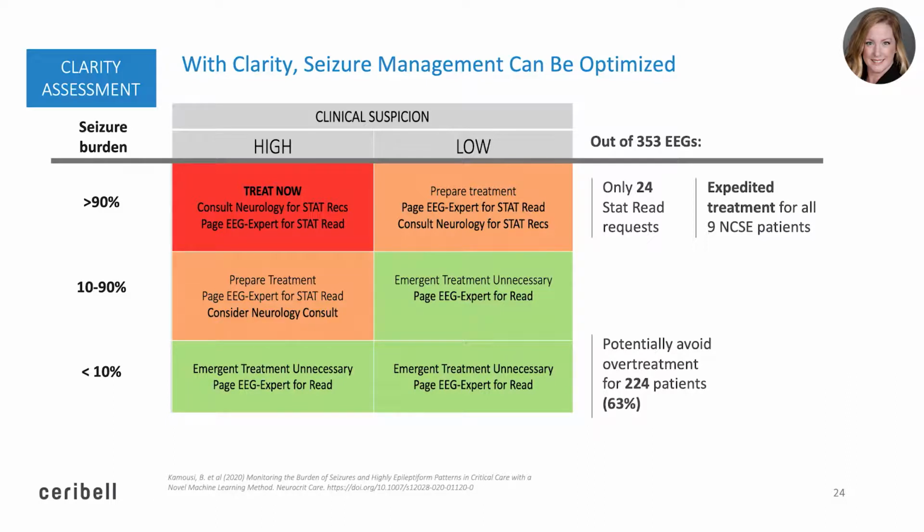Together, you are managing a medically complex patient. This matrix helps explain how your bedside neuroassessment fits into the patient's neurooptimization. It is critically important.